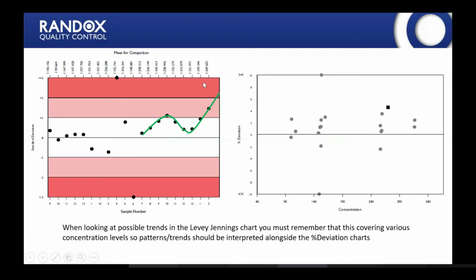But because we're covering multiple concentration levels with this, you can't just assume that this is the pattern of the lab's performance. You need to look at it in conjunction with the percentage deviation by concentration chart. And here you can see that there isn't a pattern. It doesn't matter whether it's a low or high concentration. So we've got two outlier results. You can see here, and you can see these here and here on the concentration chart.